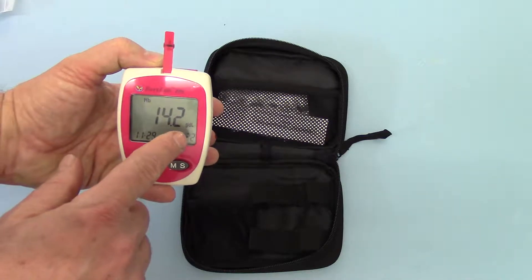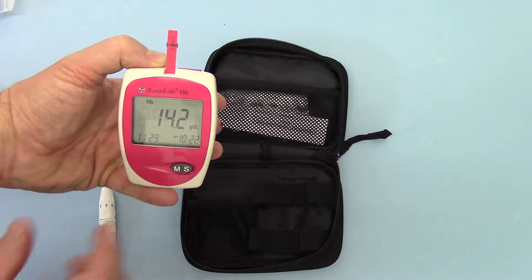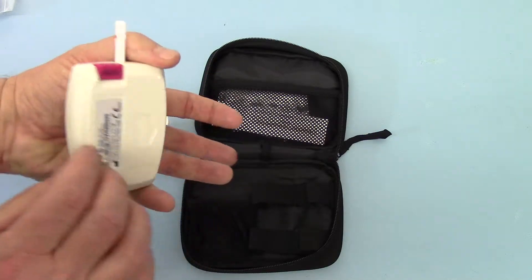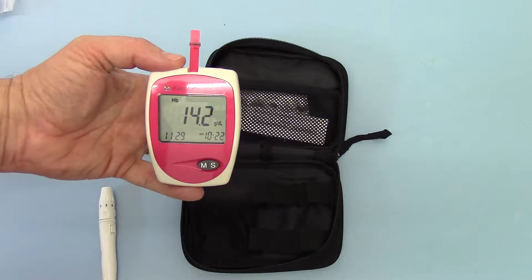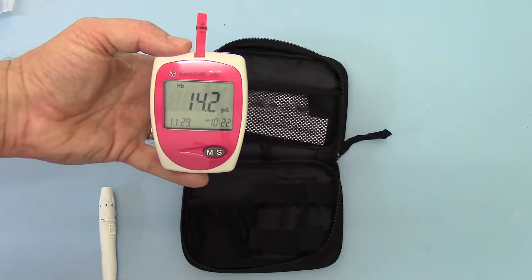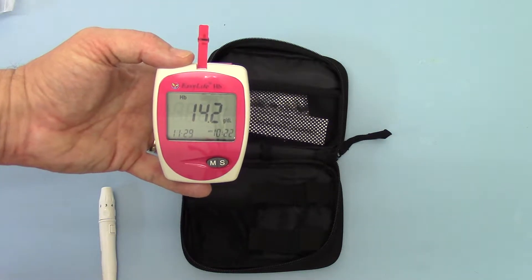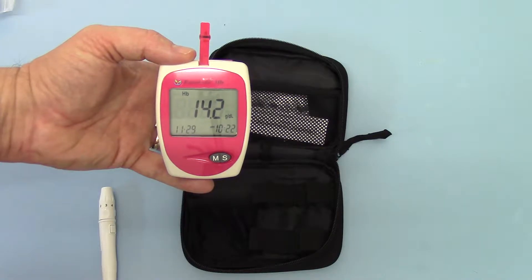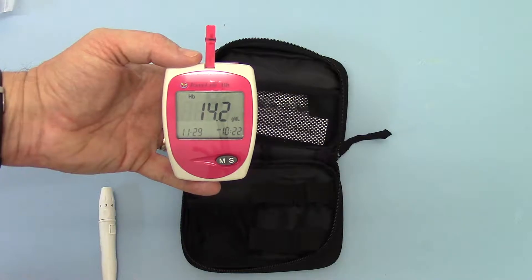Importantly, this is displayed in grams per deciliter. If it is not showing in grams per deciliter, you need to open the battery port on the reverse and click the switch inside upwards or downwards, depending on where it's pointing, so that it switches from millimoles per liter into grams per deciliter. So there we go — 14.2 grams per deciliter, which is a good indication of a healthy male haemoglobin level.